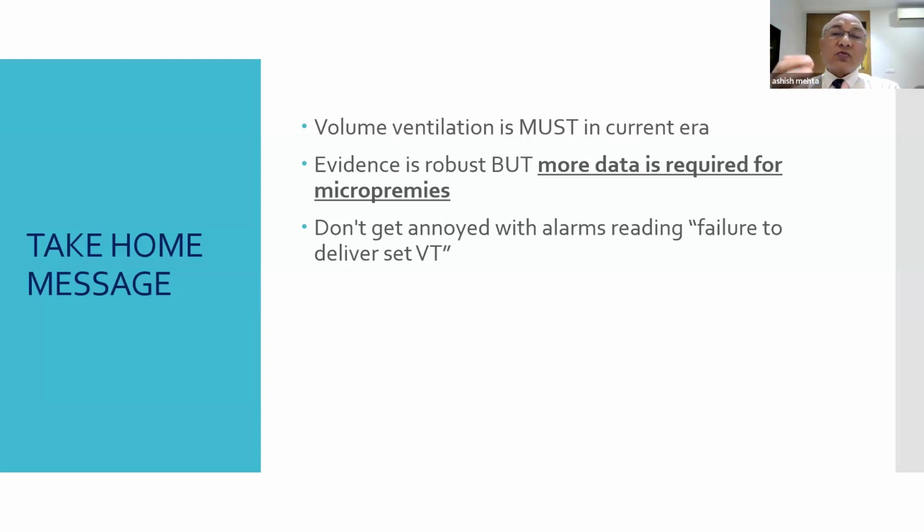That's the problem. In small babies, chest compliance is very poor. Their tubes are very small. It's difficult for them to breathe through their straw. And that is why at times they fail in targeting the ventilator itself. How can you target the tidal volume? There is a lot of dead space which they have to come through to get any help from the ventilator.